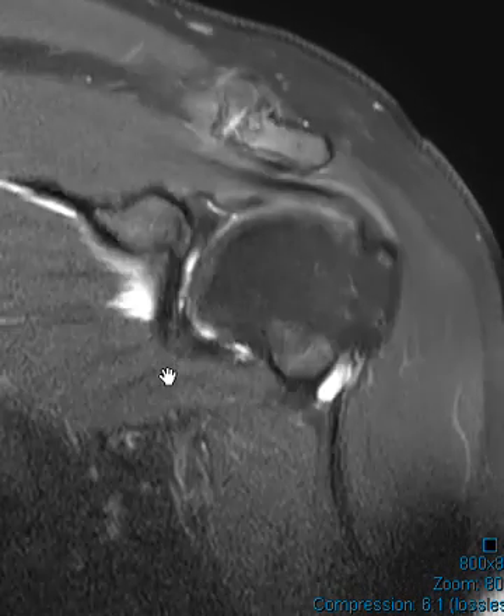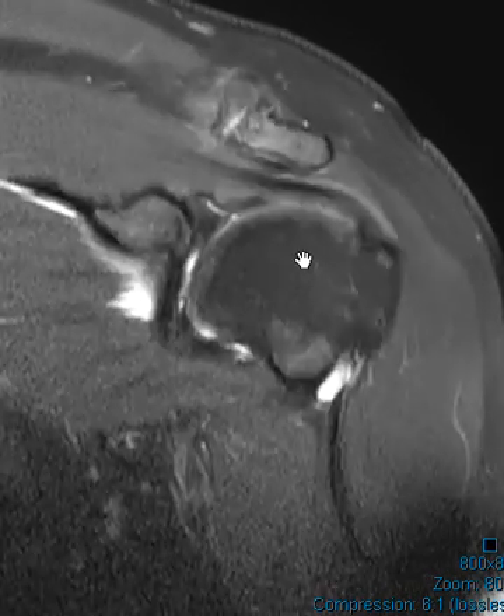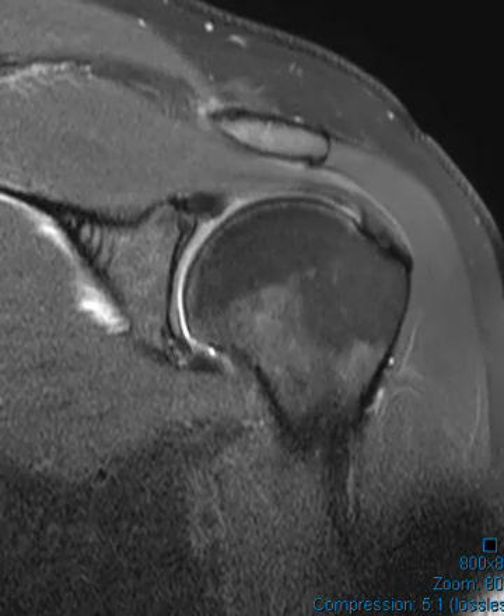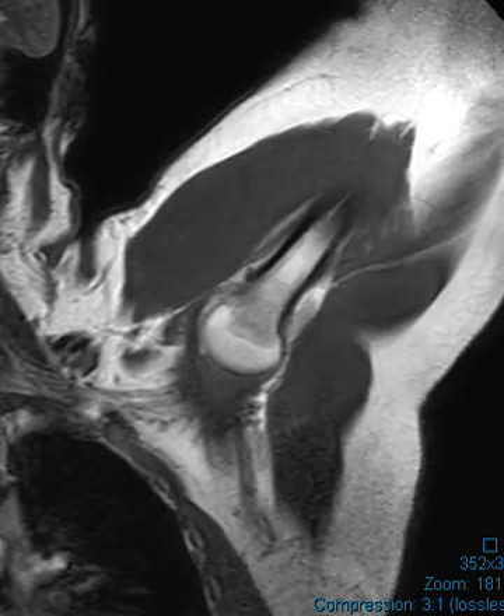We do have an ABER image where the arm is abducted and externally rotated, and that's very helpful to see the inferior labrum especially. This is a scout view — you can see how they put their arm outward, externally rotated and abducted.